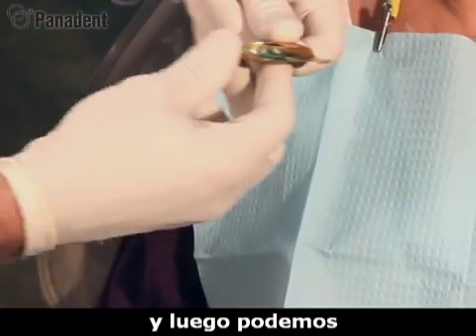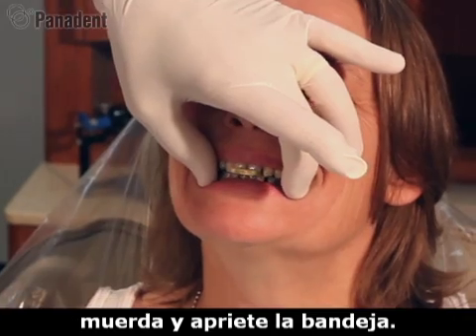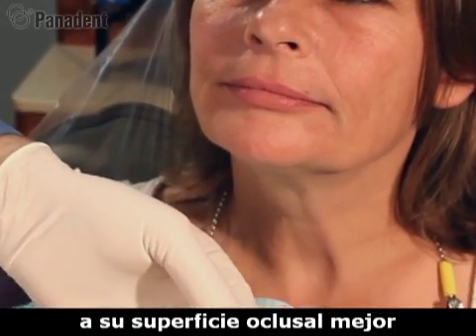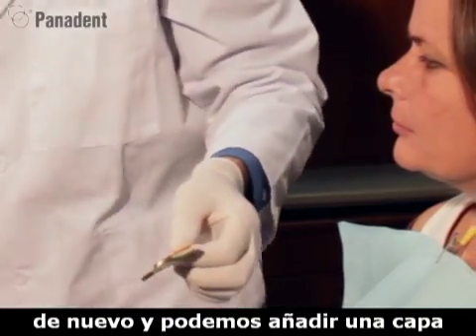Then we can go into the patient, line up the dental midline on the front of the bite tray to the dental midline, have the patient bite up and crush the tray. Open, please. This will now form the tray to the occlusal surface better to minimize the amount of opening of the centric record. We can now add or dry the upper side again.